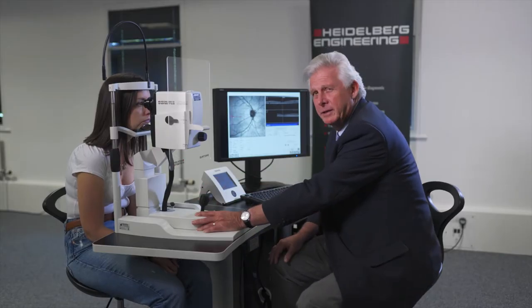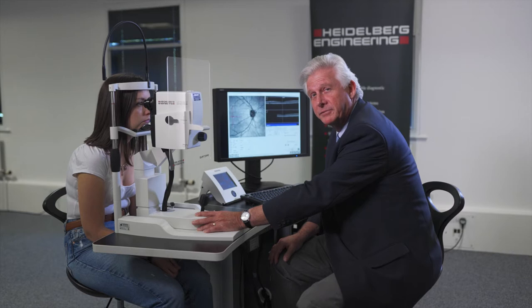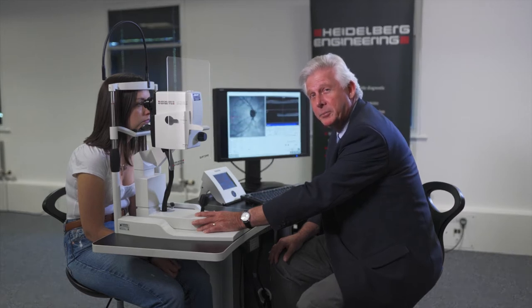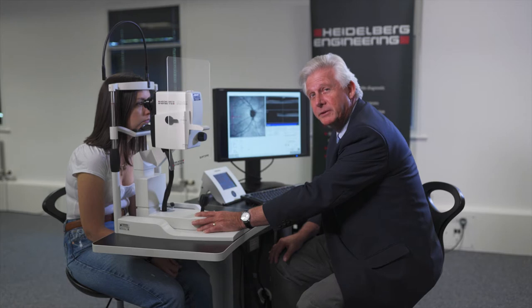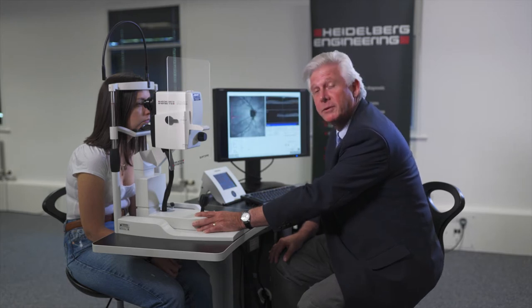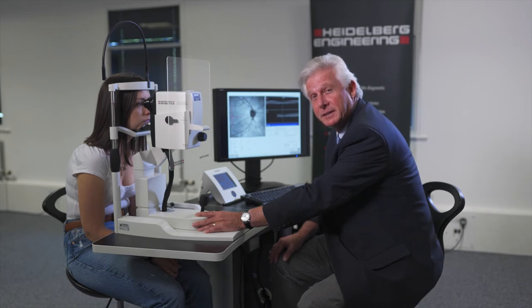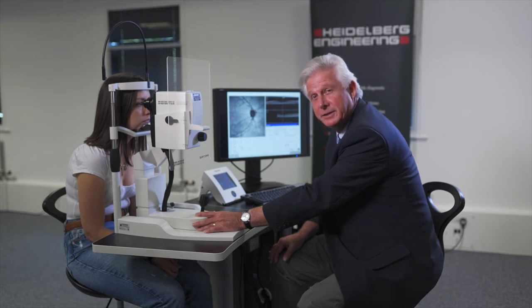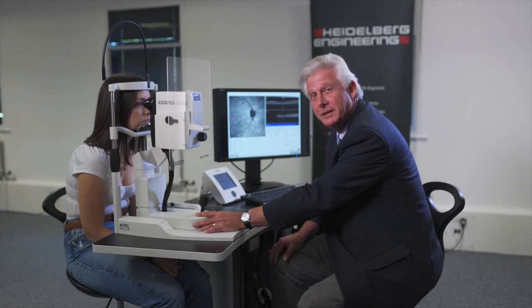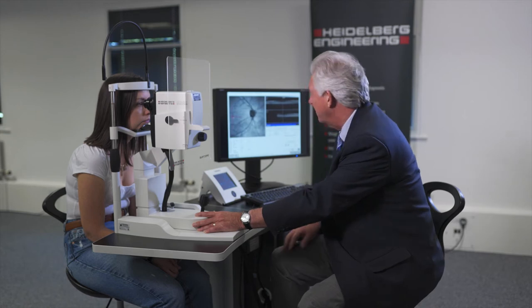What we have here is an anatomic positioning system. We're going to automatically identify the fovea and then four primary points of Bruch's membrane opening, which should be the true anatomic disc margin. We do this before any scanning because everybody has a different orientation, a different angle of the fovea to the disc, and so we need to isolate this before we start scanning.